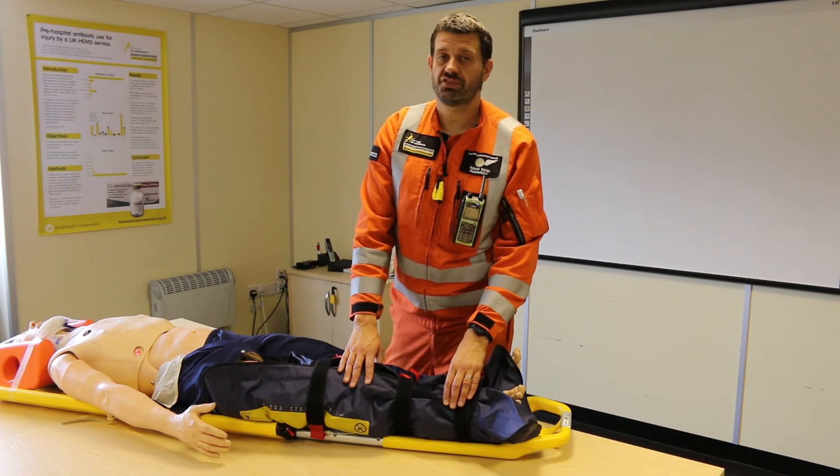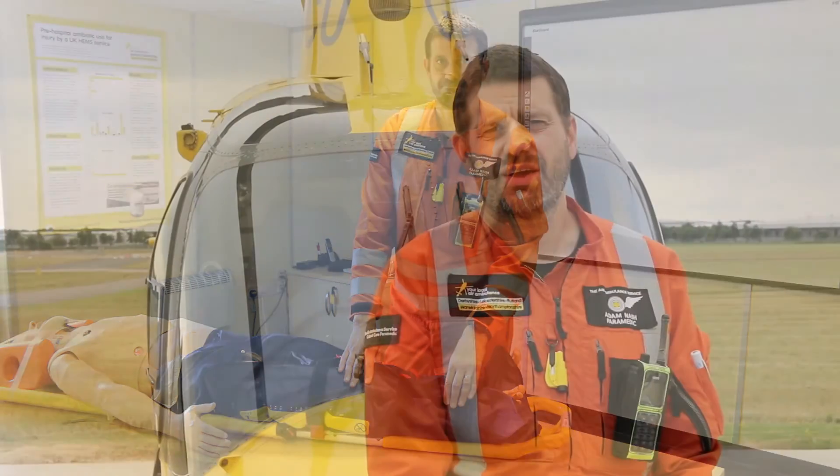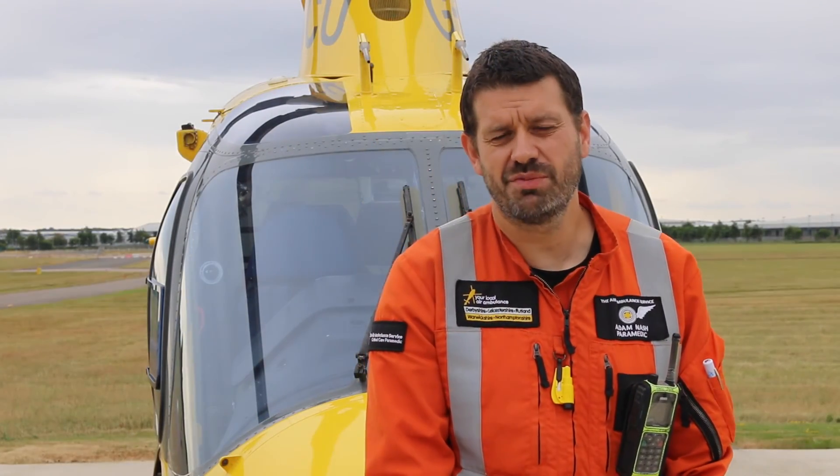And this is one of the methods that we can manage fractures in our patients using a vacuum splint. Thanks for joining us. Come and see us next week where we'll be looking at how we use our ventilator.